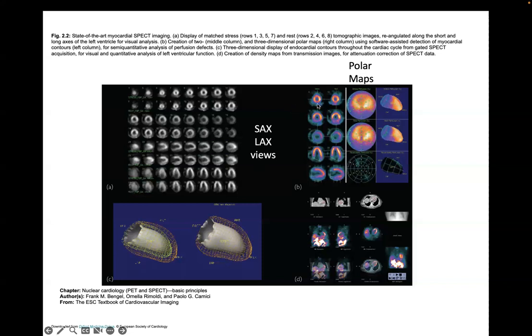If you look at these maps here, they're colorized sometimes just to increase the visibility of abnormalities. But all the color corresponds to is a single scalar value that either goes up and down. But here the bright white to orange means there's high perfusion, and this purple means there's low perfusion here. And so the asymmetry of the perfusion map here is an indication that there is low blood flow in this part of the heart. And this is done millions of times a year.